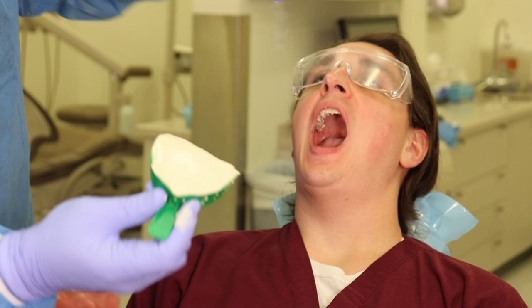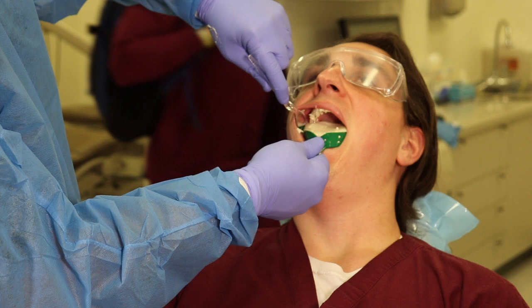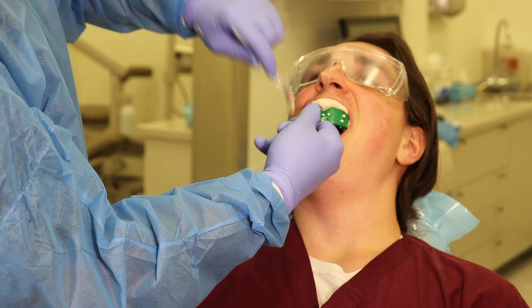Then I will retract from one side, I will put this on the other side. And then I will go all the way to the back. You see how I'm going to the back? I'm setting this part all the way to the back. And then I roll towards the front. As I'm rolling towards the front, all the excess is rolling with it.